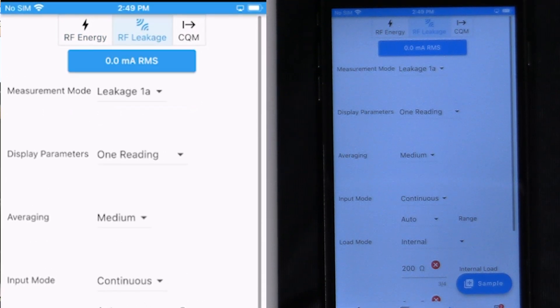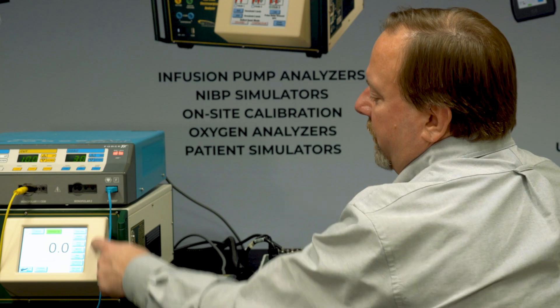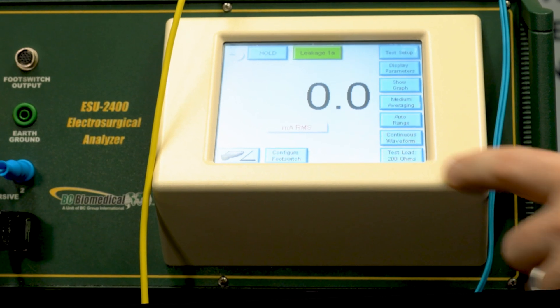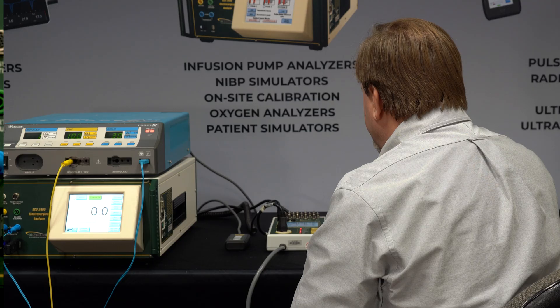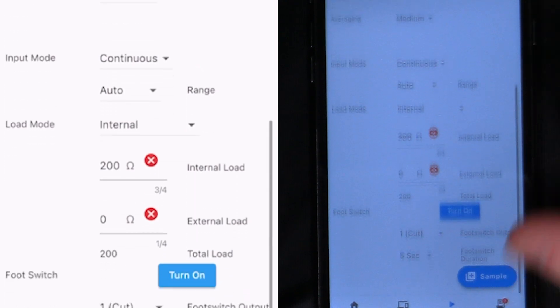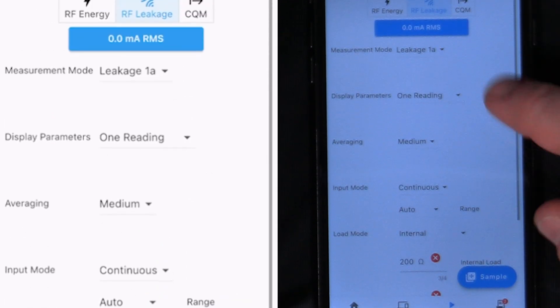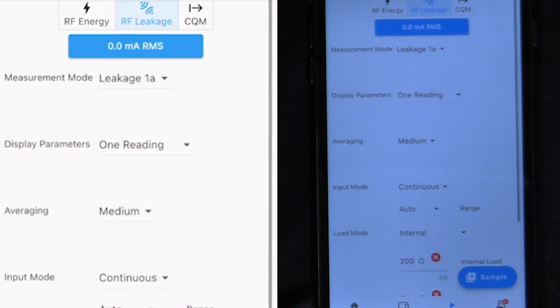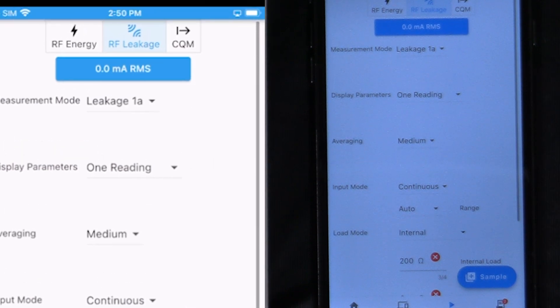The same kind of thing here. We have all of the settings available on the screen of the 2400. Those are available on the MyBC Mobile app. We can set the load, we can set the measurement mode, how many readings are on the screen. All of that is configurable right here very easily.